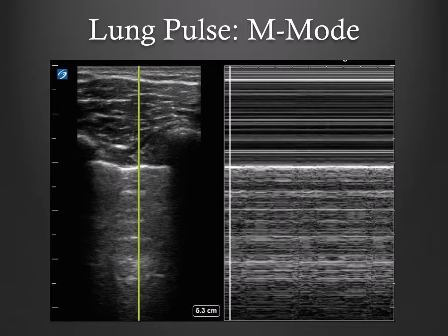Lung pulse describes a subtle rhythmic movement of the pleura that is synchronous with cardiac beats. This can help rule out a pneumothorax, particularly in patients with complex lung appearance. Here's what it looks like in M-mode, where you can see vertical stripes of sand in the seashore sign.